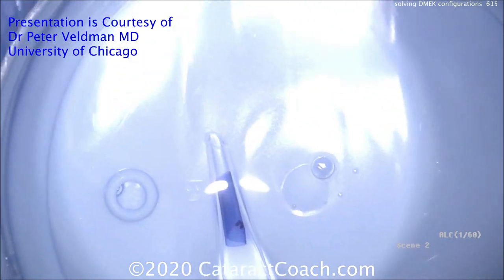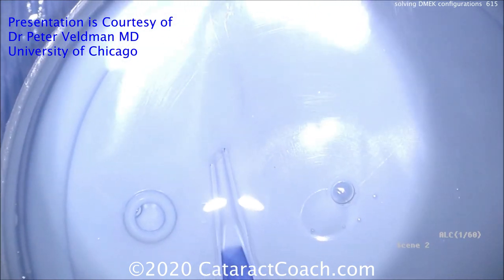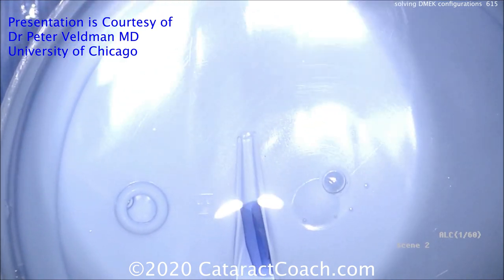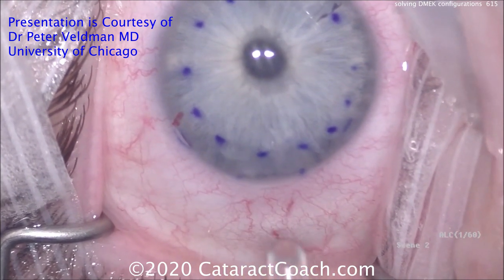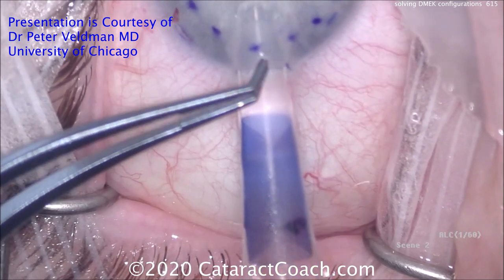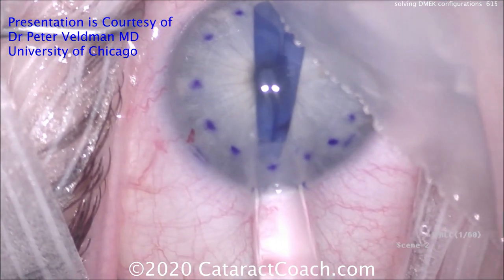Now let's look at the beginning case with the loading of the graft — a really great trick from Dr. Veldman: start off in a great configuration. He's drawing up balanced salt solution, and this is the graft in the Jones tube. He's drawing it back and pushing it down, over and over, to get the desired configuration. He'll get a beautiful double fold — look at that. Now that's going to make life a lot easier. When you already start off with the graft in the correct orientation and with a double scroll at the beginning of the case, you make the case so efficient. This is how advanced, experienced corneal surgeons can do this whole procedure in just a few minutes.